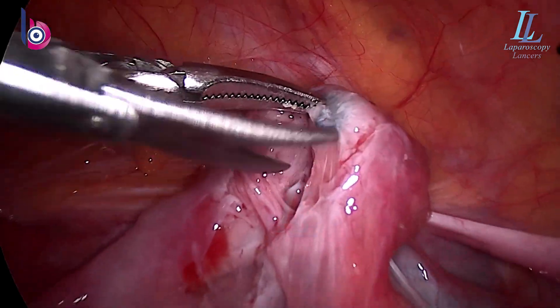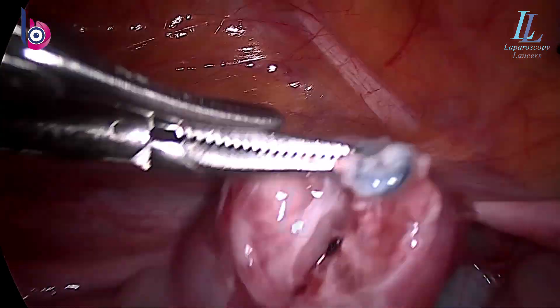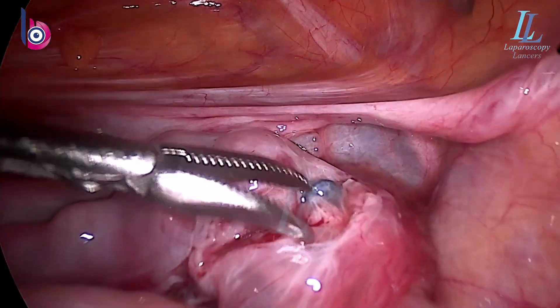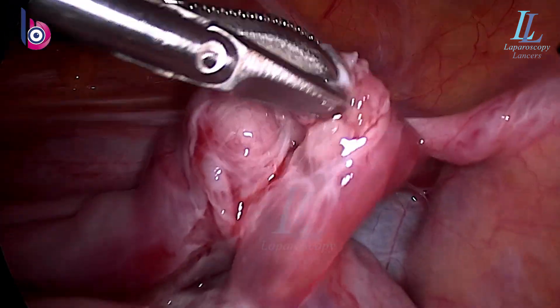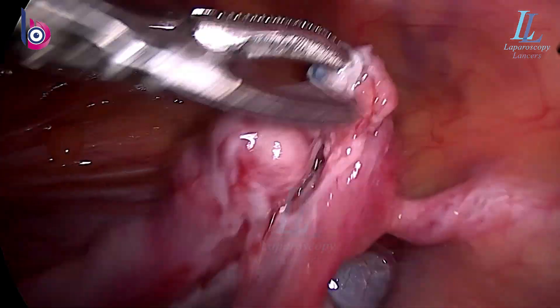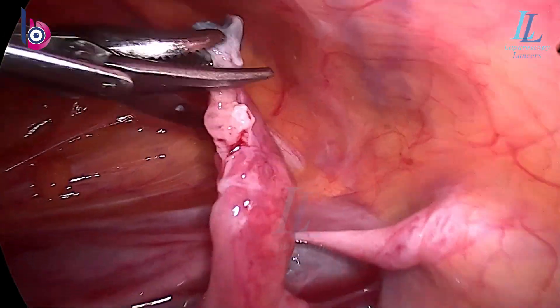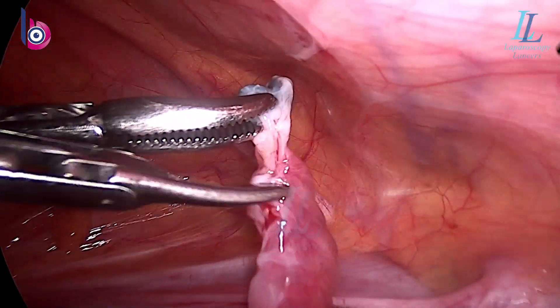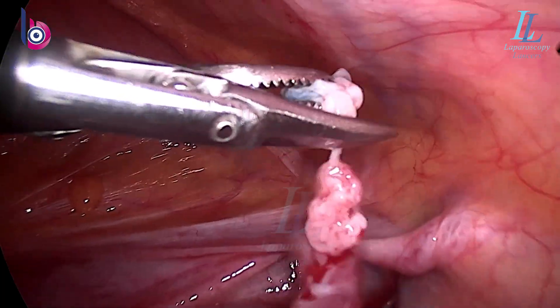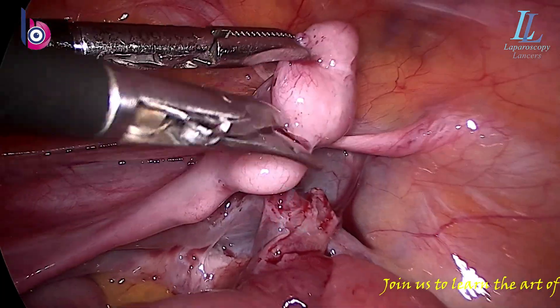You can see it appears to be a silk suture — later confirmed that it was silk. I am trying to remove the silk suture using unilateral 5 mm ports and regular 5 mm instruments. It looks a bit like butchery over there, but what else could have been done? If you have any better idea, please do comment. That's the opening of the fallopian tube laterally going into the fimbria — I have never seen the opening of the fimbria, because such things never happen in a tubectomy case.